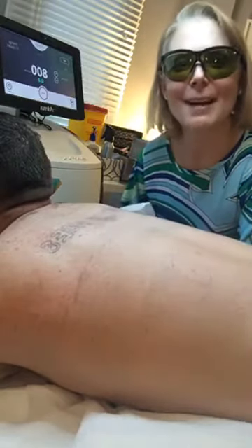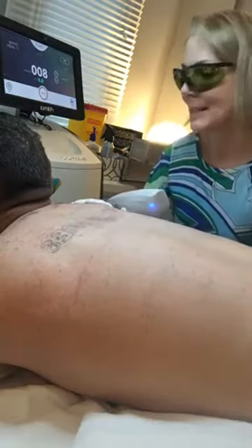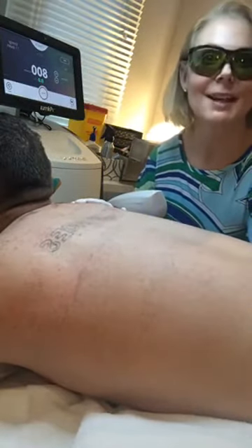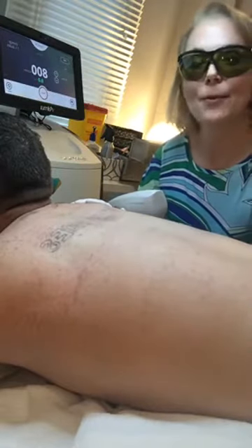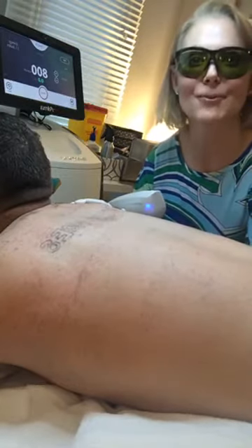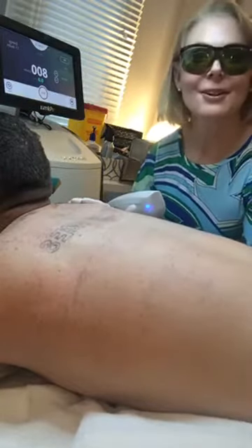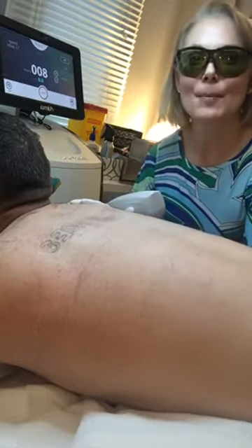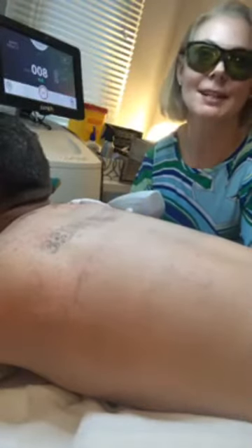Hello again, this is Mike — he's come back for his second tattoo treatment and he's been kind enough to agree to let us film his session today. This is treatment number two. We were chatting before we came on camera and he says he's had about a 20% reduction already with just one session, which I'm very pleased about. He put some freezing cream on for about 45 minutes before the session, which should make today very comfortable.